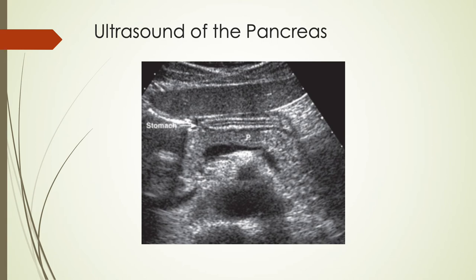Because the stomach is positioned anteriorly to the pancreatic body, we can sometimes have the patient drink some water so the stomach fills up with fluid and acts as an acoustic window to let us see through to the pancreas. If I'm having a hard time seeing the pancreas at the beginning of my scan, I'll take representative images of whatever I can see, sweep through the visible anatomy, do the rest of my exam, and come back at the very end — the bowel gas obstructing the pancreas may have moved by then.